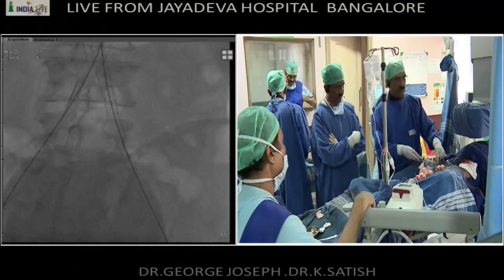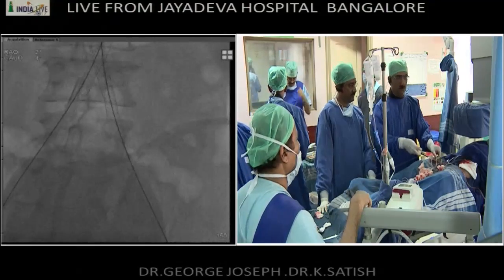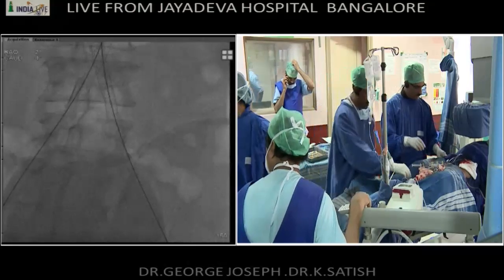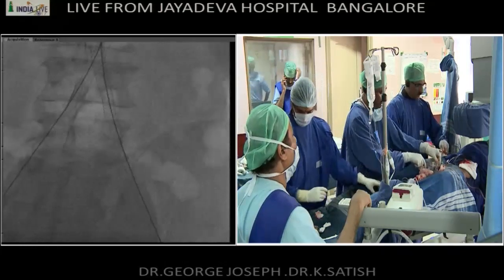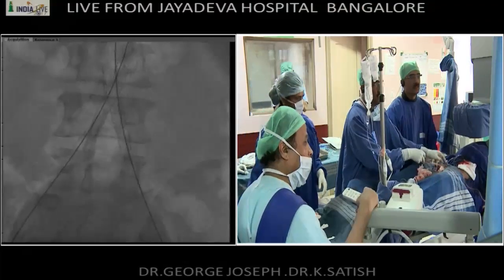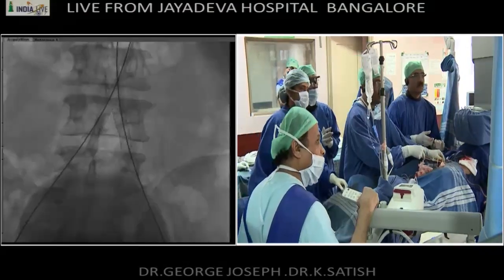Okay, so we are done. I think we can just take a picture and see how things are. Can you inject from the other side? Give me some contrast. You inject, count of 3, yeah? Okay. Center the stents, please. Demag completely. Yeah, okay. We are ready? Yes. Count of 3. 1, 2, 3.